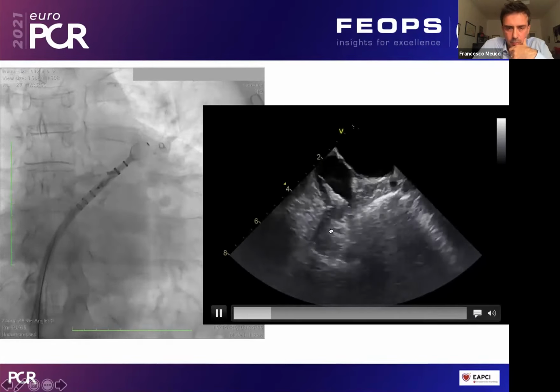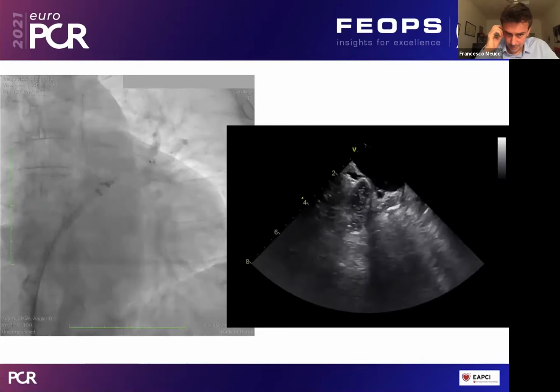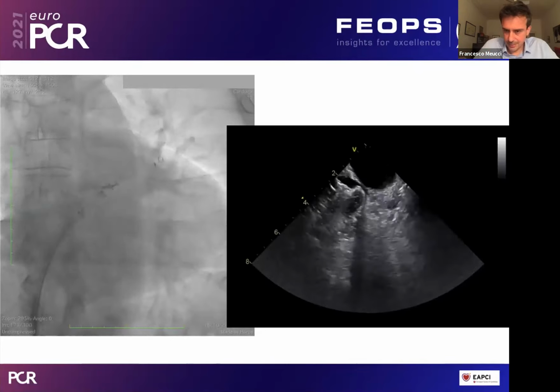And this is the opening of the device by the unsheathing maneuver. So once you reach the distal position, you have only to unsheath very easily this device. And as you can see, the maneuver is quite smooth and easy. I mean, the device is not jumping anywhere, stays where you predicted it has to stay, and you are very relaxed in terms of repositioning or recapturing. It is not a hard maneuver. Let's say like this, it's a smooth maneuver.